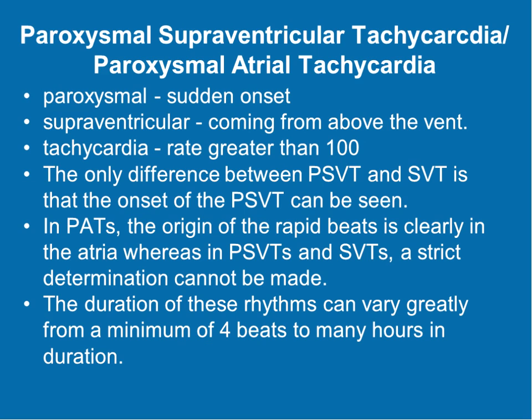The duration of these rhythms can vary. They can just be a few beats, or they can actually last for several hours. Now, when we talk about atrial fib, we could also call that a supraventricular tachycardia, because when AFib is going very fast, it can be hard to see the trademark irregularity of AFib. So we call it supraventricular tachycardia, and then if we're able to slow the heart rate down, then we can actually see this AFib.